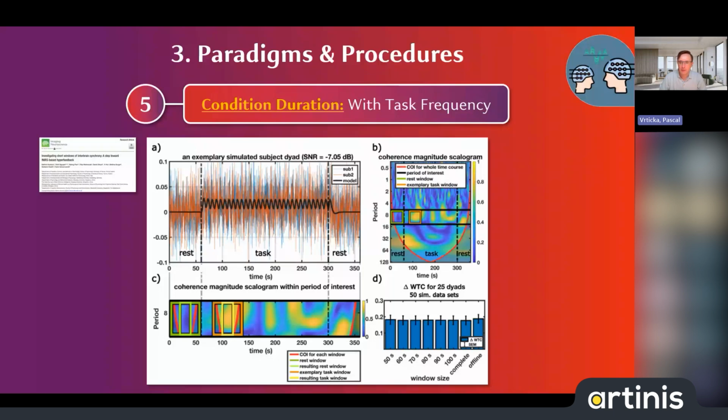You should think of at least a task duration of 30 seconds, maybe ideally a minute to 2. And so you have to think rather in a block than in event-related design that you might be accustomed to from EEG studies or jittered rapid fMRI paradigms. Right.